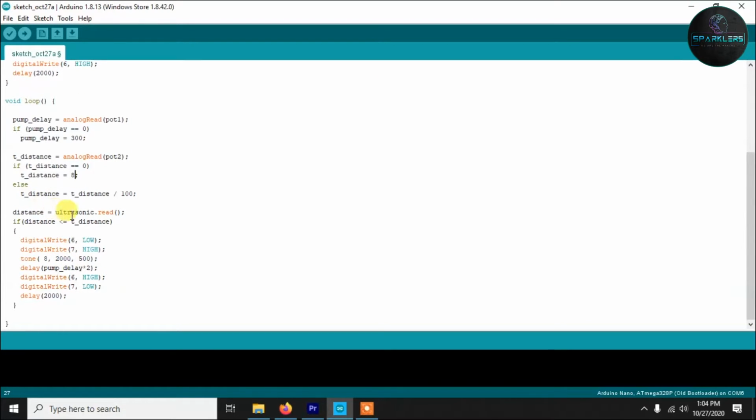Now finally we are reading the ultrasonic value from the ultrasonic sensor, and if the distance is less than the t distance which we have set previously, then our pump will be turned on and all the other things will turn on. So what will happen, at first the pump will turn on. For that we will make pin number 6 low. After that the LED will turn on, so we have made pin number 7 high. Then the buzzer will beep.